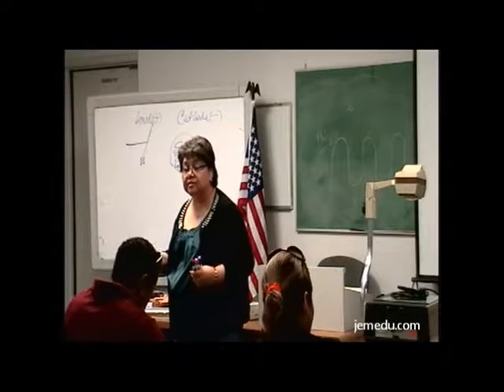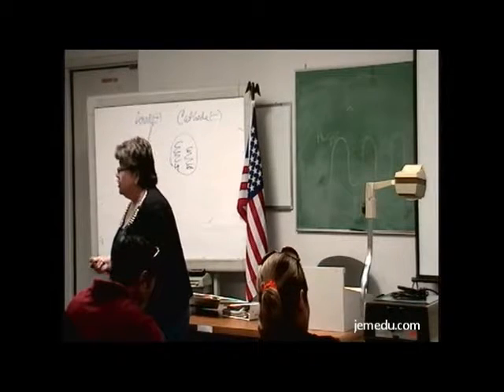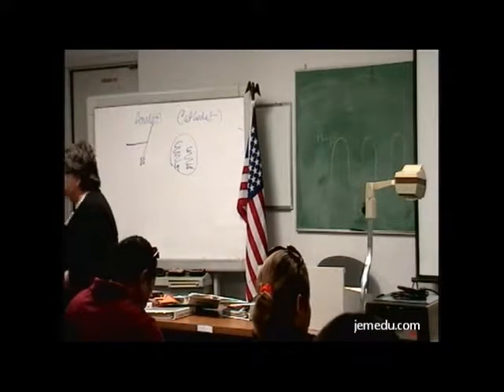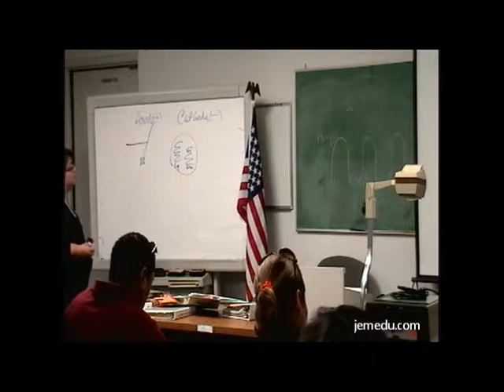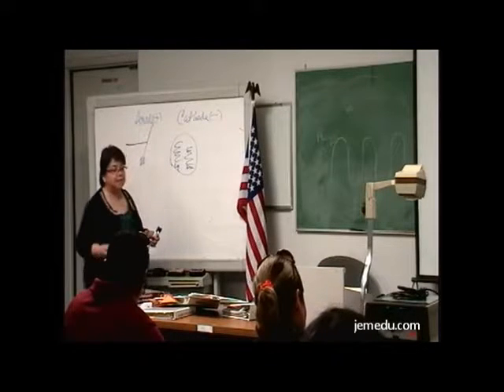And the number one thing you need to say is because it has a high melting point. Everything else that you know to be true is actually true, but the test usually wants to hear that high melting point as the answer. But the other ones are actual as well. All right, now, the filaments are going to get hot. What's going to cause those filaments to get hot?